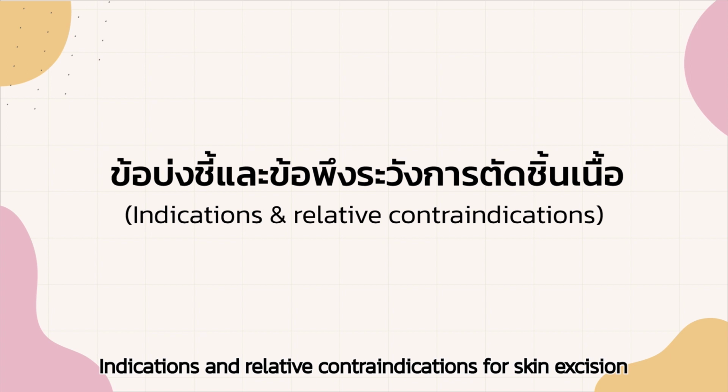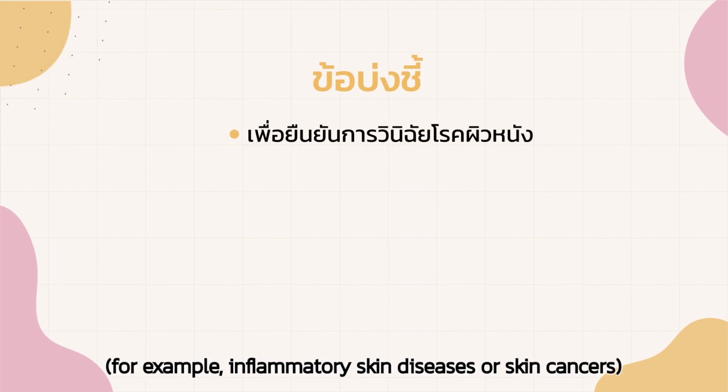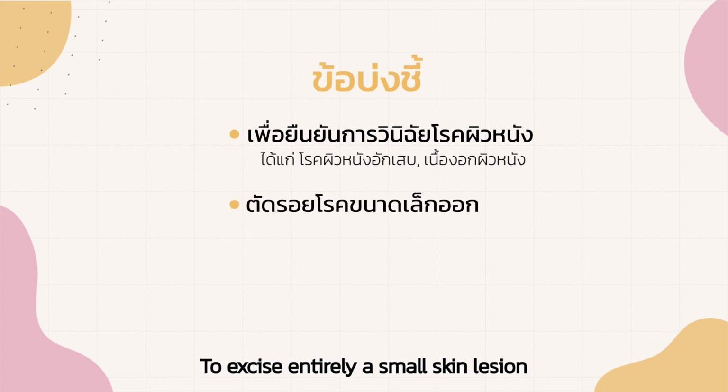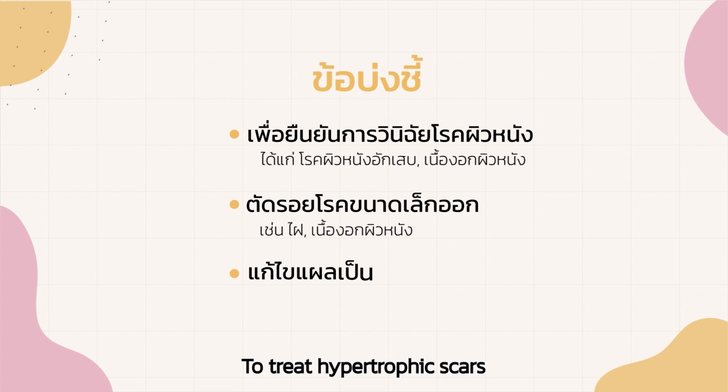Indications and relative contraindications for skin excision. To confirm the diagnosis, for example, inflammatory skin diseases or skin cancers. To excise entirely a small skin lesion. To treat hypertrophic scars.